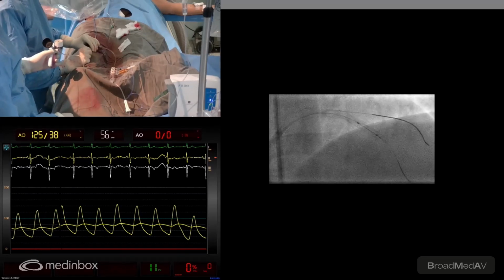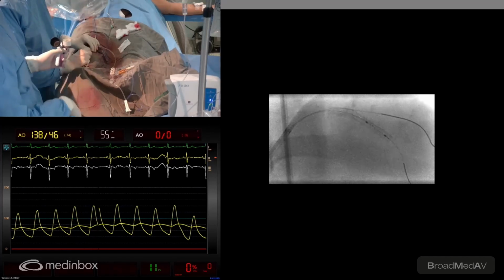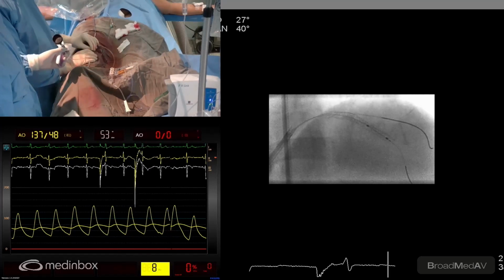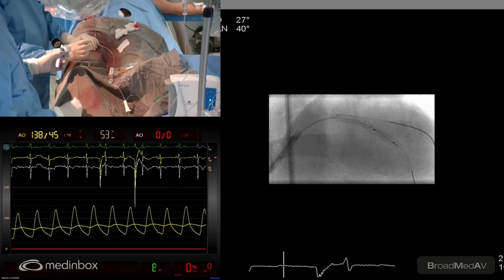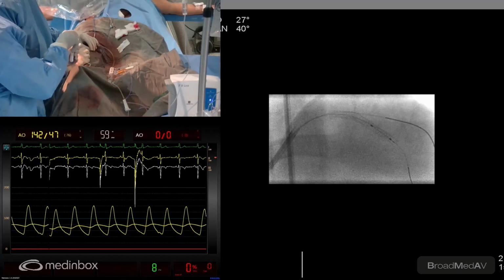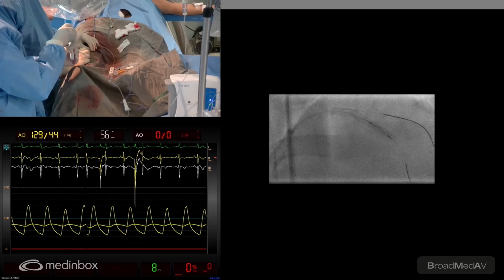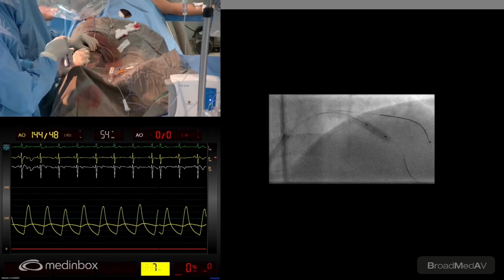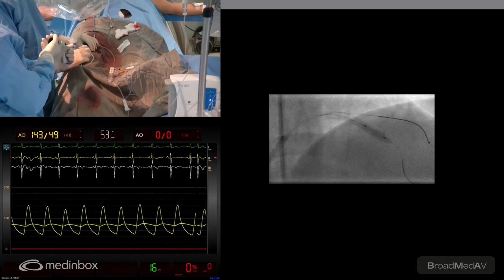Yes, I think cine now. Okay, we still have some distance to go. Let's go ahead anyway. I think where the wire marker tip starts: 4, 5, 6, 7, 8, 9, 10, 11, 12, 13, 14. Deflate.